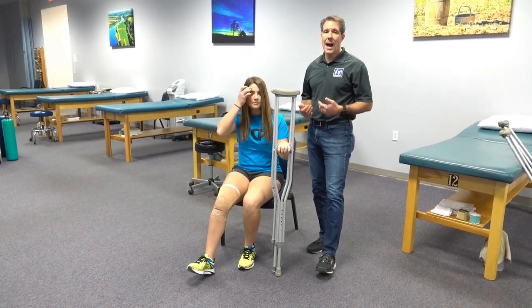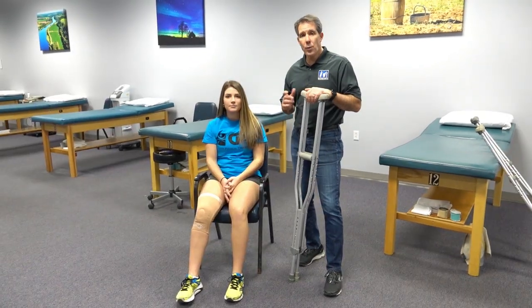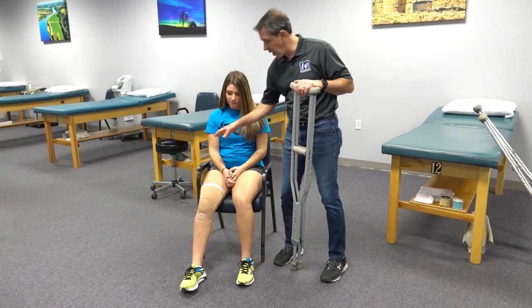So that is how you get out of a chair and into a chair with crutches. Now we're going to show you how to get up out of the chair when you have a chair that has armrests.